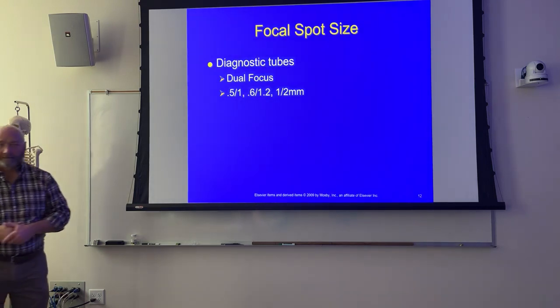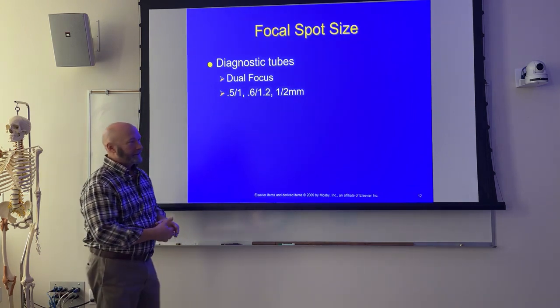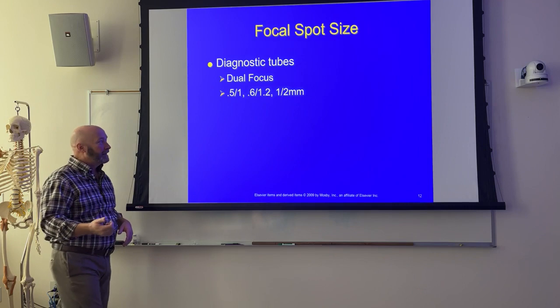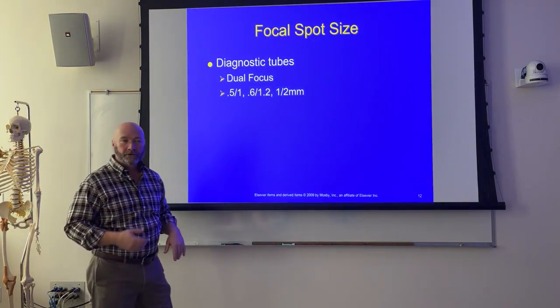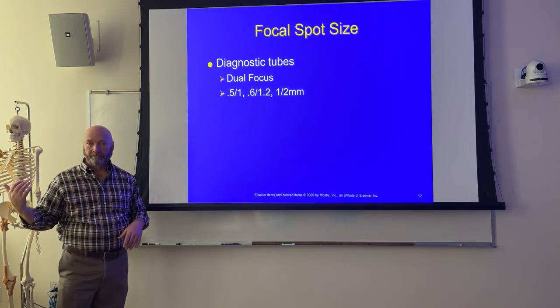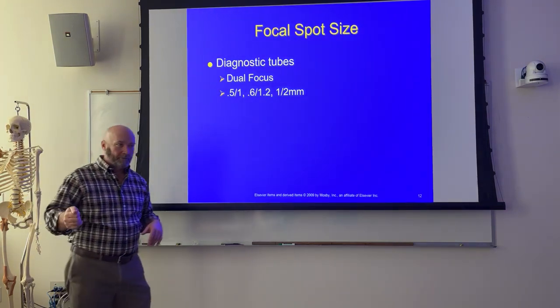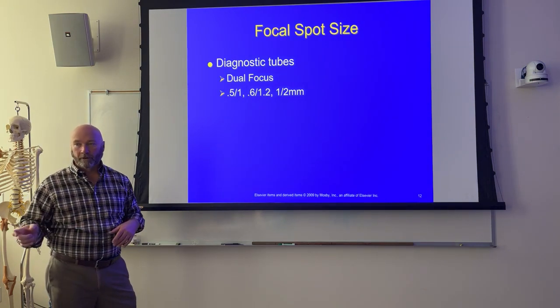Roll it back up to this. Now, we talked about this in the last section. When you attempt to make an exposure on a small focal spot size, and you're utilizing a high MA, your machine's not going to let you do it, right? It's just going to shut it down. You try to press rotor, and it'll probably beep at you, and if you look, it says tube overload.